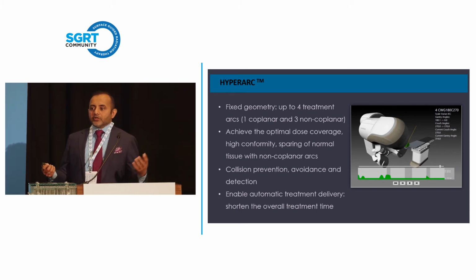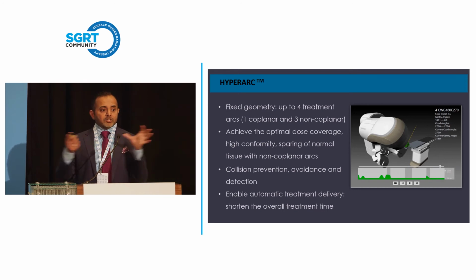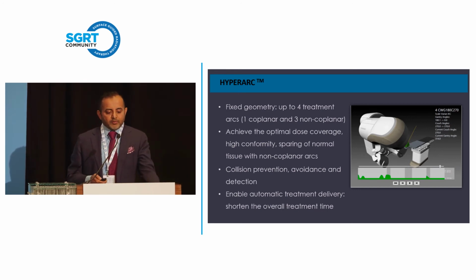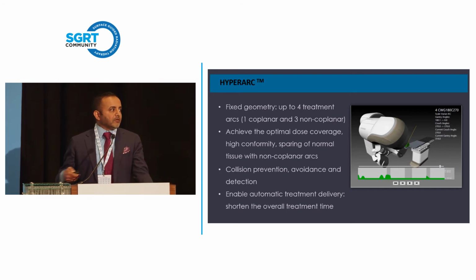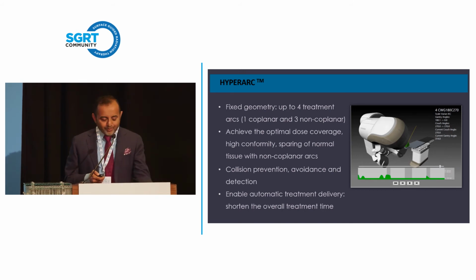So, typically in radiosurgery, we aim for a gradient of 0.5. With HyperArc, we're seeing gradients of 0.3 to 0.4. So that means that the radiation dose fall off is exquisitely rapid. The other thing HyperArc really allows for is that it builds in a collision prevention system. So you don't have to do a QA to make sure that the fields are going to clear. And with this technology and surface guidance, we're literally booking patients into 15-minute time slots, and oftentimes double booking because my therapists are so great that they get through these cases very quickly.